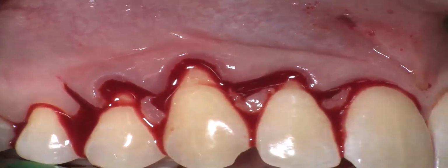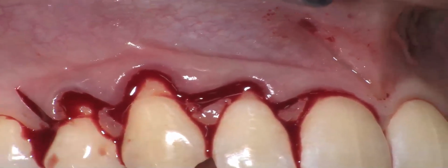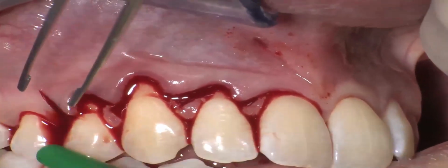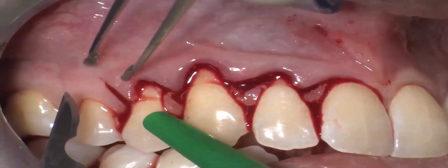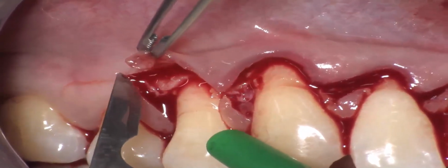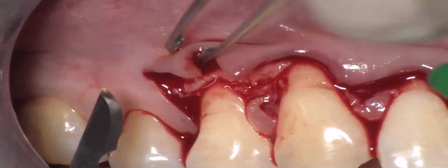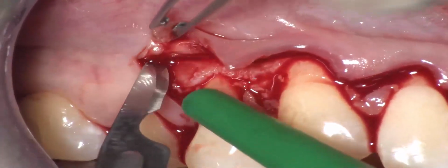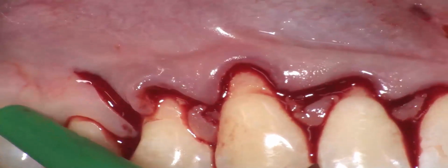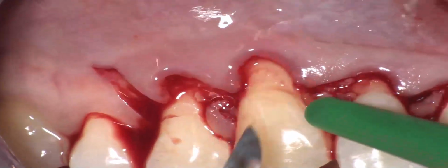So, voglio la 15C? No, C. So I will make a deep incision, tieni qua. First of all, I will use the vertical releasing incision, which has already been designed with a very split thickness incision in order to avoid any scar formation. And then I continue this incision by keeping the blade parallel to the bone.